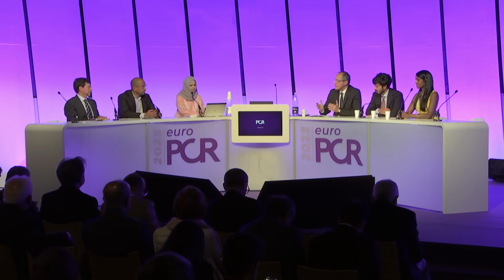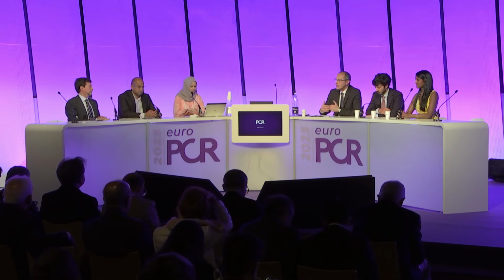But what I'm interested in, and perhaps we can start from the right side of the table, is the role of drug-coated balloon in the side branch. Does it have a place here? It's already a lot of calcium there. It's a long lesion. You might want to avoid additional metal. Is there any room for this technology? Well, it's a very appealing option, but unfortunately, we still don't have clear evidence supporting that, and the industries are not supporting this use.